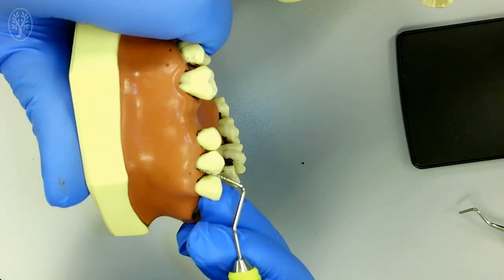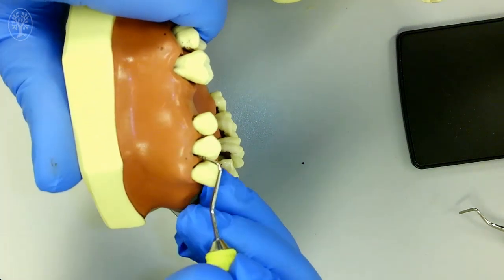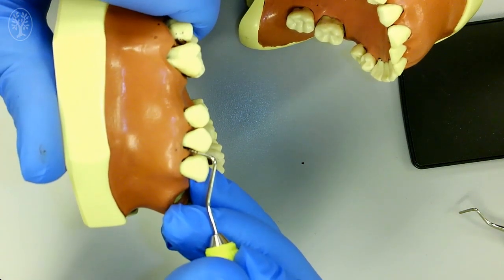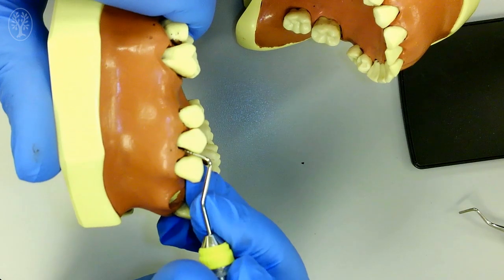From there, insert the probe fully into the sulcus and see how much further the probe enters the pocket. Here, it is 7 more mm from the cement-enamel junction, which is the attachment level. You can also see the probe depth here, which is 8 mm from the gingival margin to the base of the pocket.